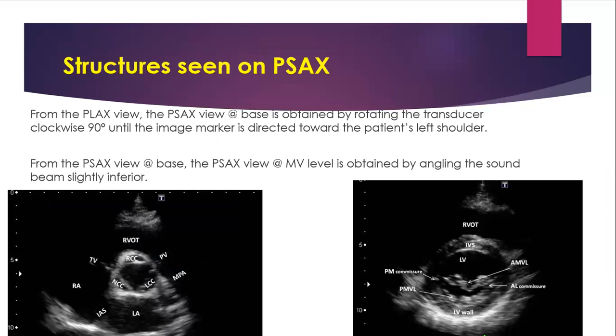So let us see what structures you see in the parasternal short axis view. In this parasternal view, first of all, you should understand how to rotate the probe.